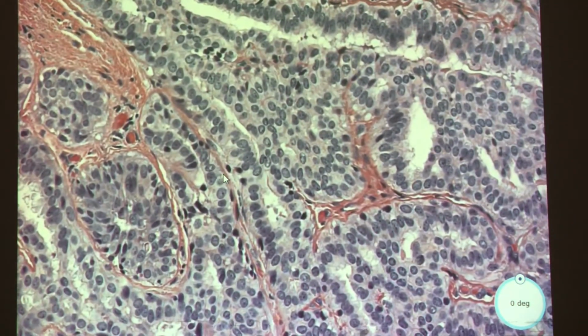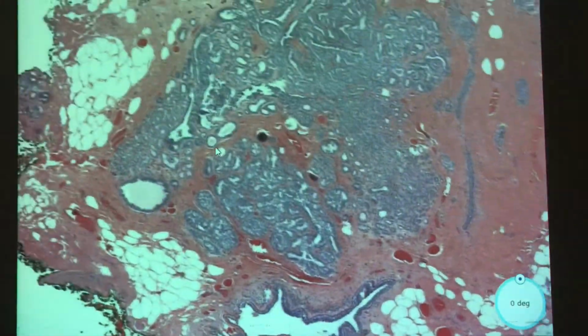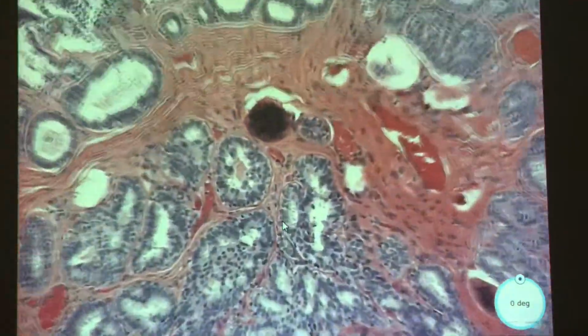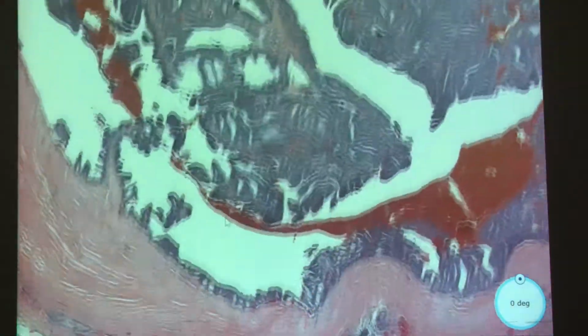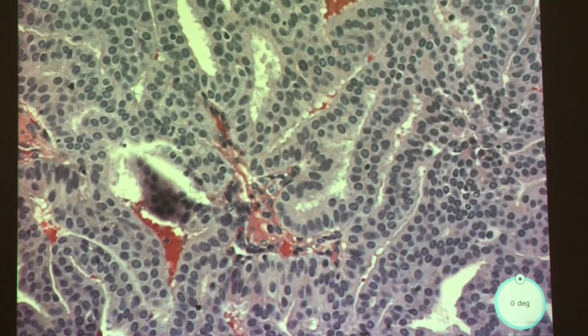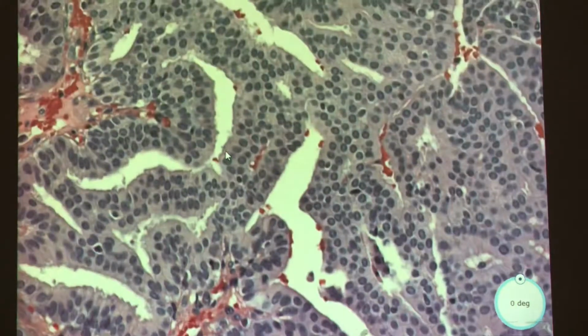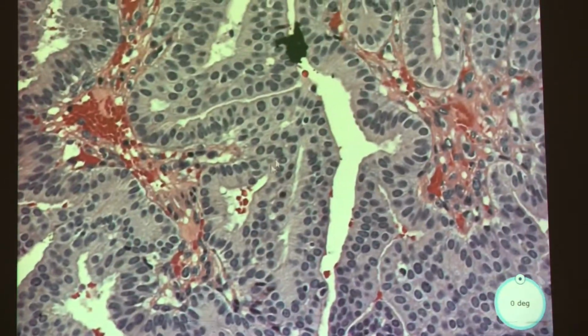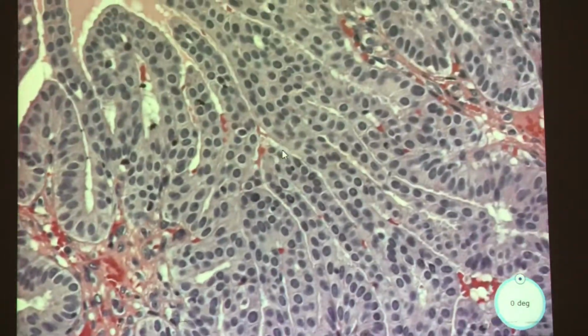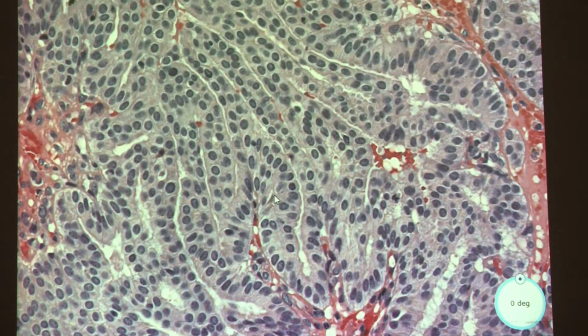Now, remind me, is there a scoring system for DCIS in terms of how many points? So it's not really points. I might be thinking of something else. It's like a personal threshold. There are metrics as to how pleomorphic the cells must be to call high grade. I believe it's like 3 to 4 times a regular breast cell, but pretty much if they look wildly different, and you have really weird mitotic figures, which in this I would not say many, it's still low grade.